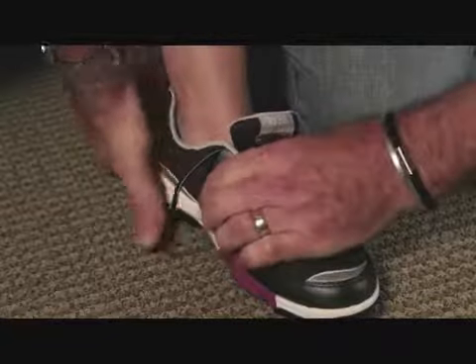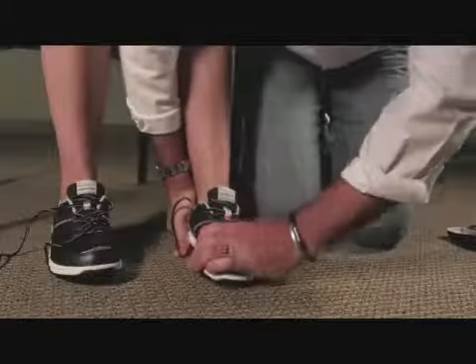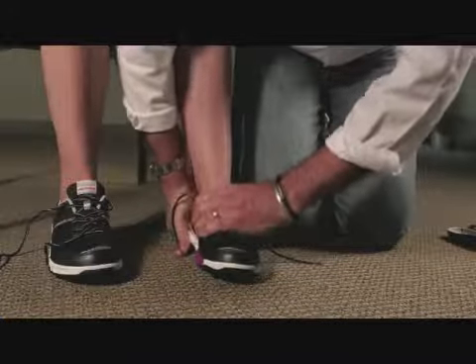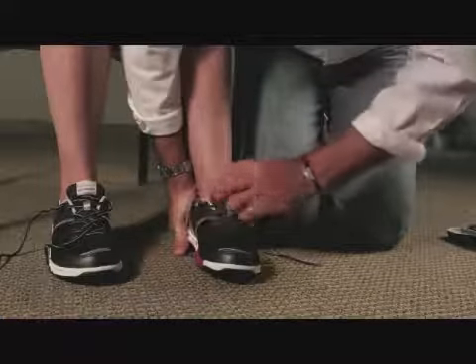We now mould the orthotic to the foot position, down through the forefoot. That gets any rear foot to forefoot lie in the footwear, up into the arch area, and cupped around the heel.